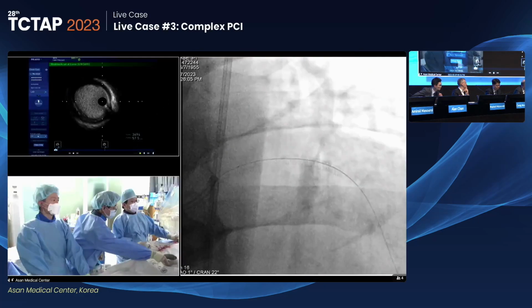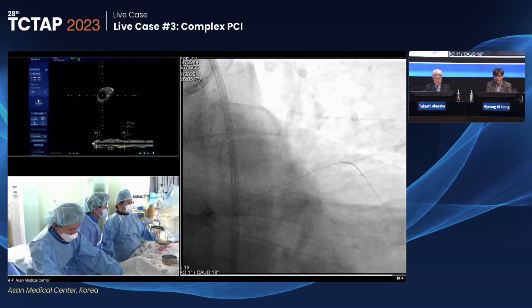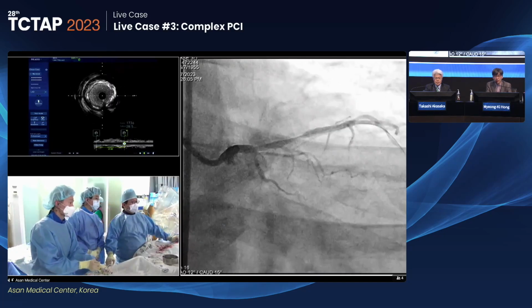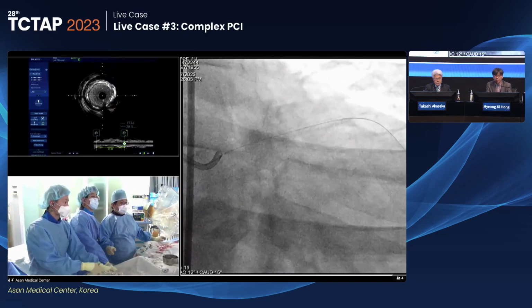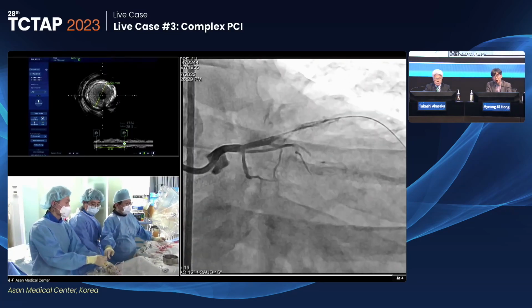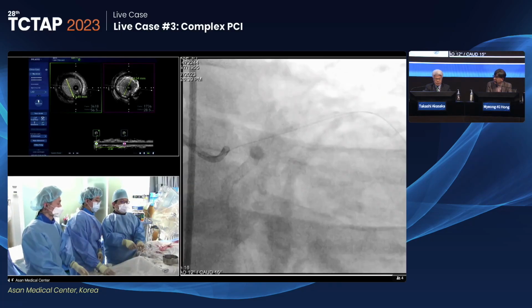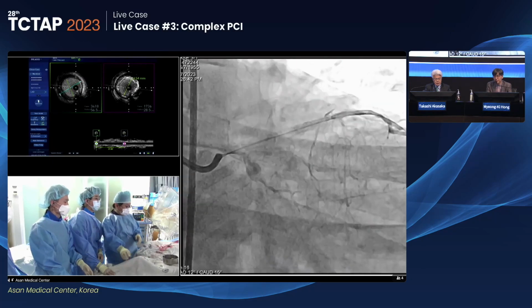Why do we need to know about the neointimal characteristics? That is very helpful for planning the next step. What I mean is that the neointimal characteristic looks like some lipid. It means that it is easily compressible. If the plaque character itself is fibrotic or calcium, it means that we have to ablate. But in these cases, based on the image, the plaque itself is easily compressible.